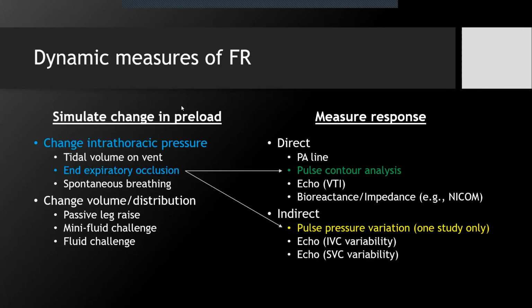So back to here. So we talked about tidal volume on the vent, connecting it with pulse pressure variation, connecting it with SVC variability. There's also end expiratory occlusion, which has been studied, where people aren't so caught up in the tidal volume, but have done studies connecting end expiratory occlusion with pulse contour analysis, which I'll show you on the next slide. And that has been demonstrated also to be a reliable measure of fluid responsiveness.